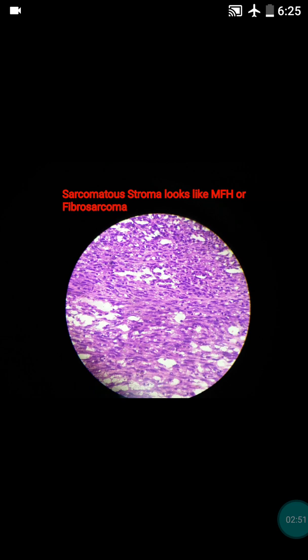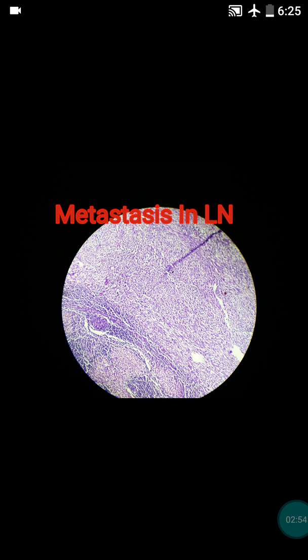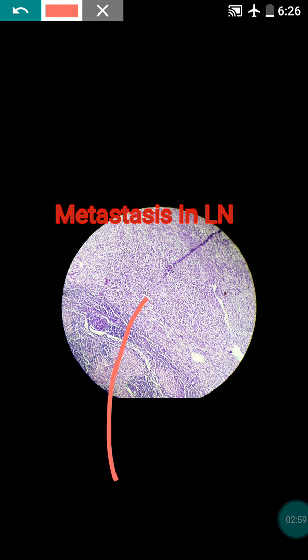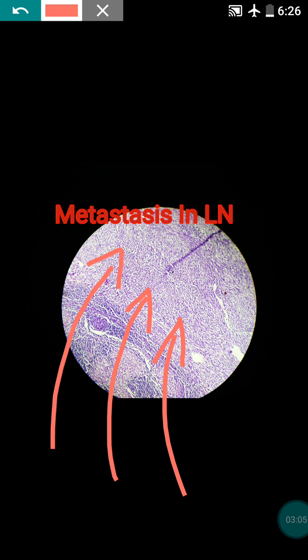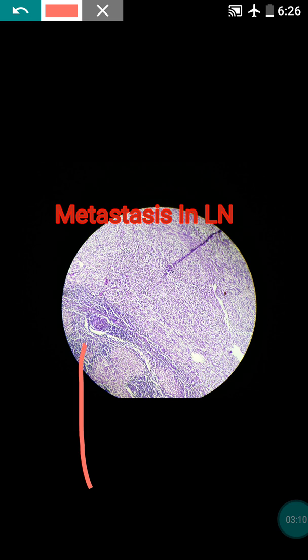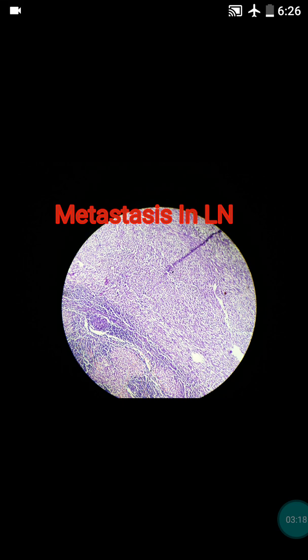One more important feature is that the tumor had metastasized to a lymph node. You can see the sarcomatous stromal phyllodes cells that have metastasized into the lymph node — the lymphoid cells are visible even though the capsule is not clearly seen. This lymph node was invaded by malignant phyllodes cells, which is why we labeled this case as malignant phyllodes tumor.